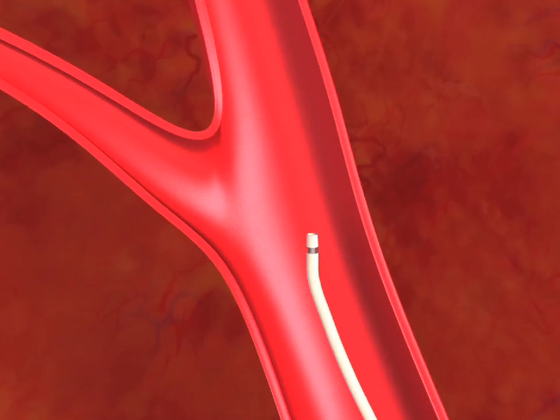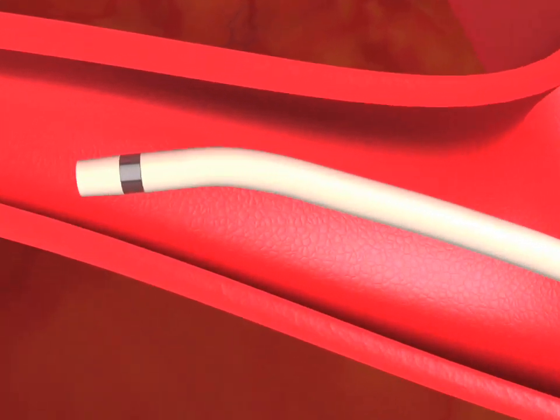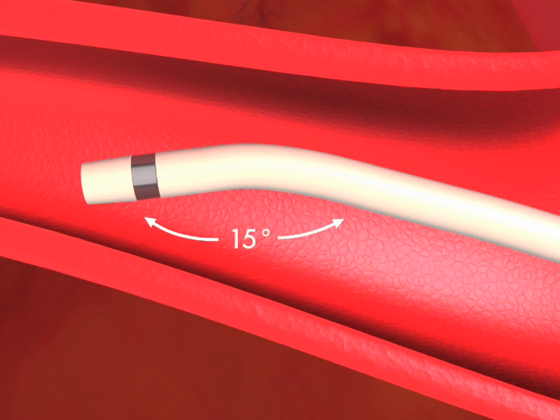In order to promote steerability, the six French and seven French snare catheters are designed with a unique 15 degree angle tip.